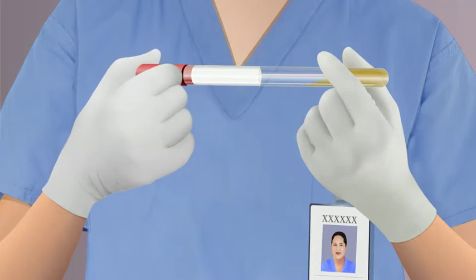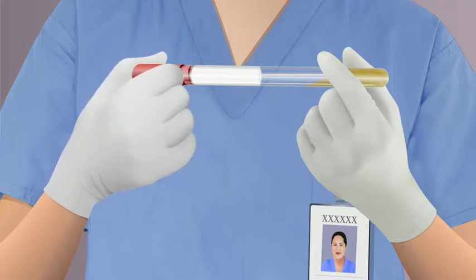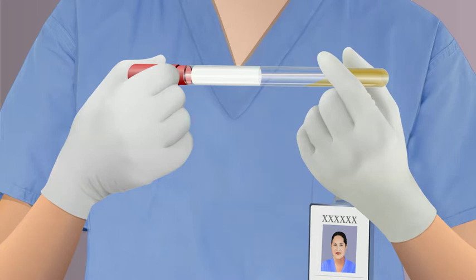Collecting a nasal specimen for culture. Have the swab and the culture tube ready for use. If using a pre-packaged culture swab in a tube, loosen the top so the swab can be removed easily.